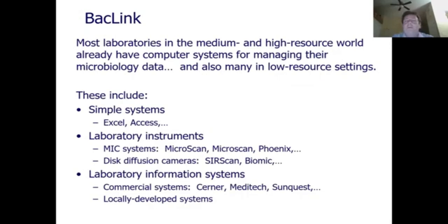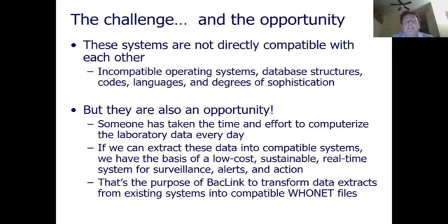So just to repeat what I just said, most labs in the medium and high resource world already have computer systems. Also many in the low resource world, such as Vitek and MicroScan, Excel or Access or other local systems, as I mentioned in the lower part of the slide. This is a challenge. These systems are not compatible with each other. Different languages, operating systems, hardware, Macintosh, Unix, Windows, data structures, languages, French, Spanish, Chinese, and degrees of sophistication. So that's a challenge, but it's an opportunity.